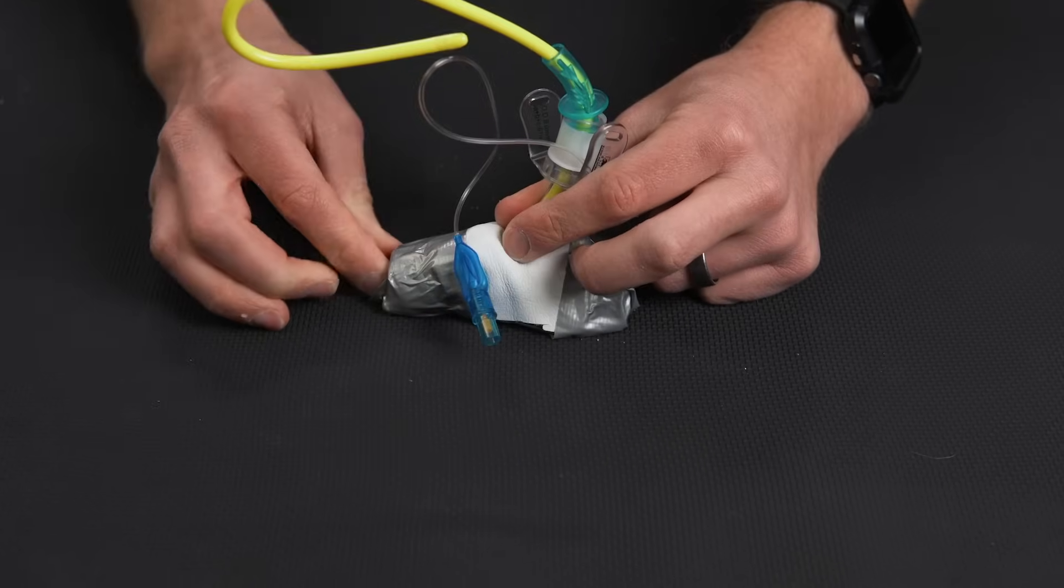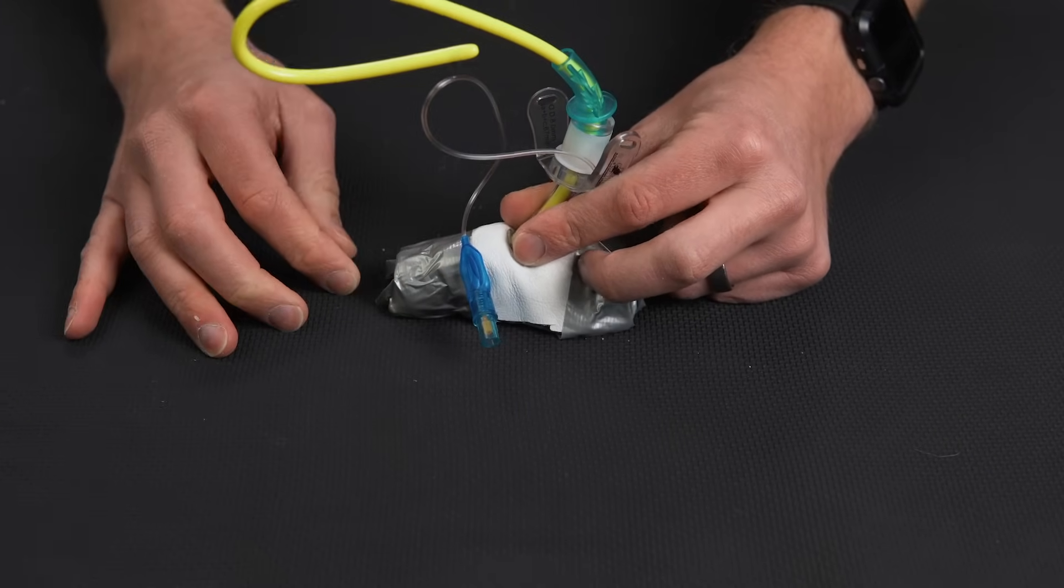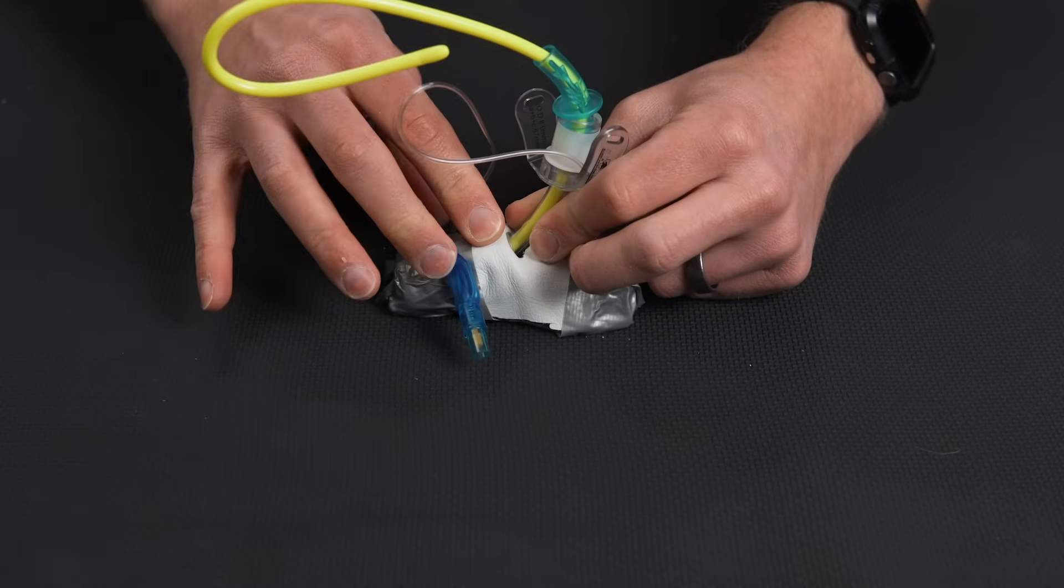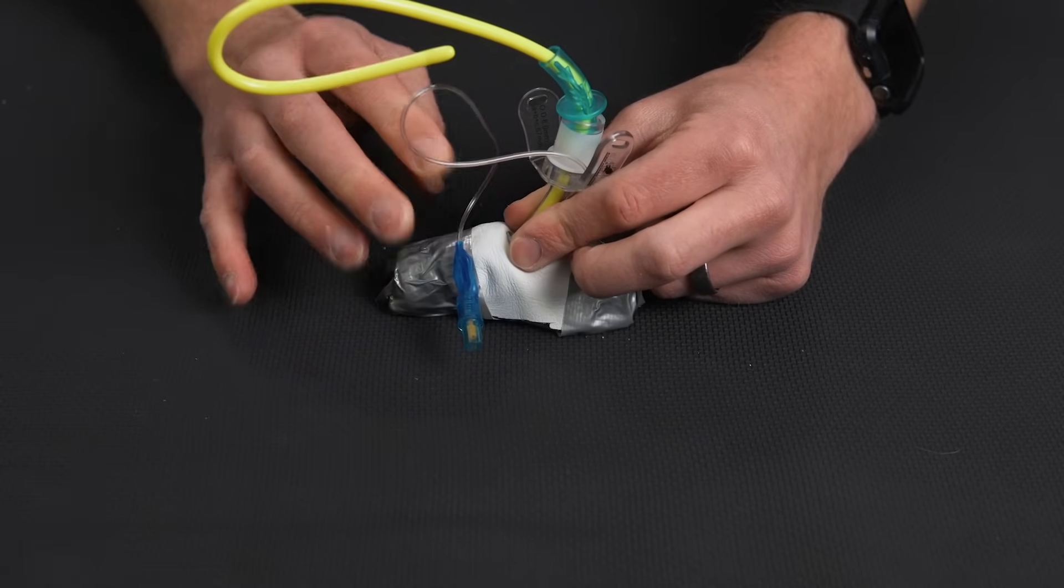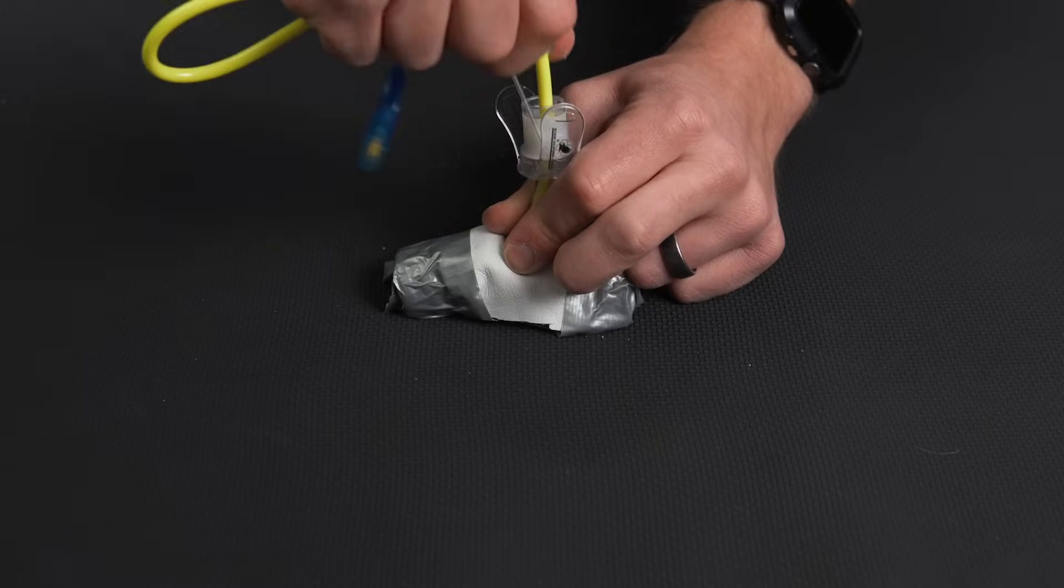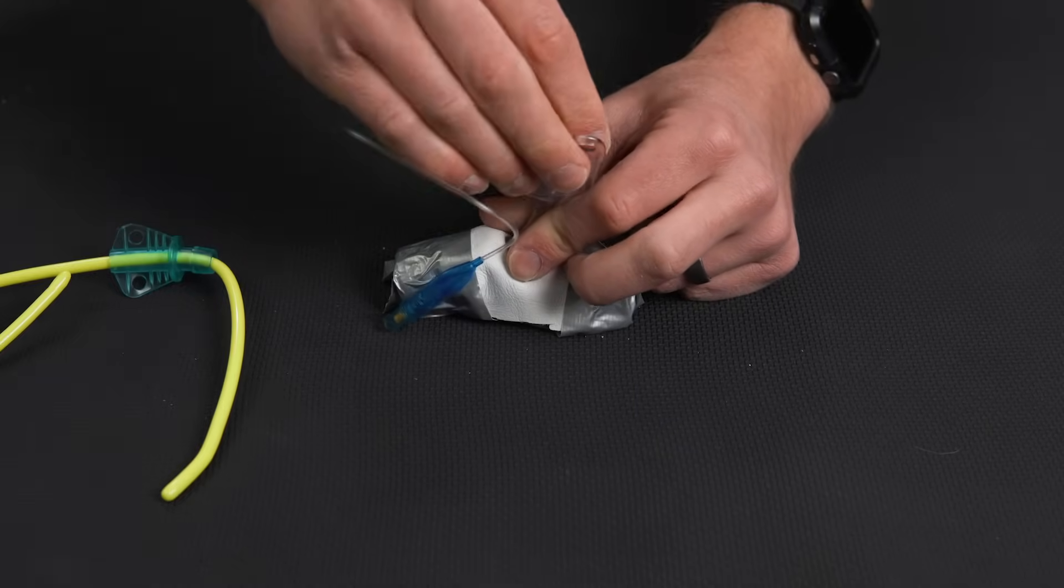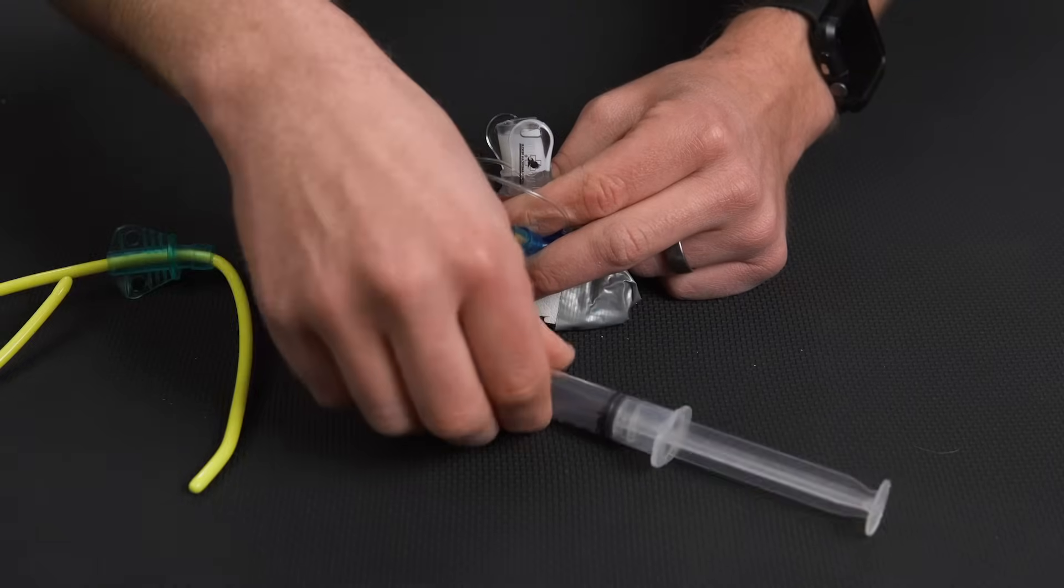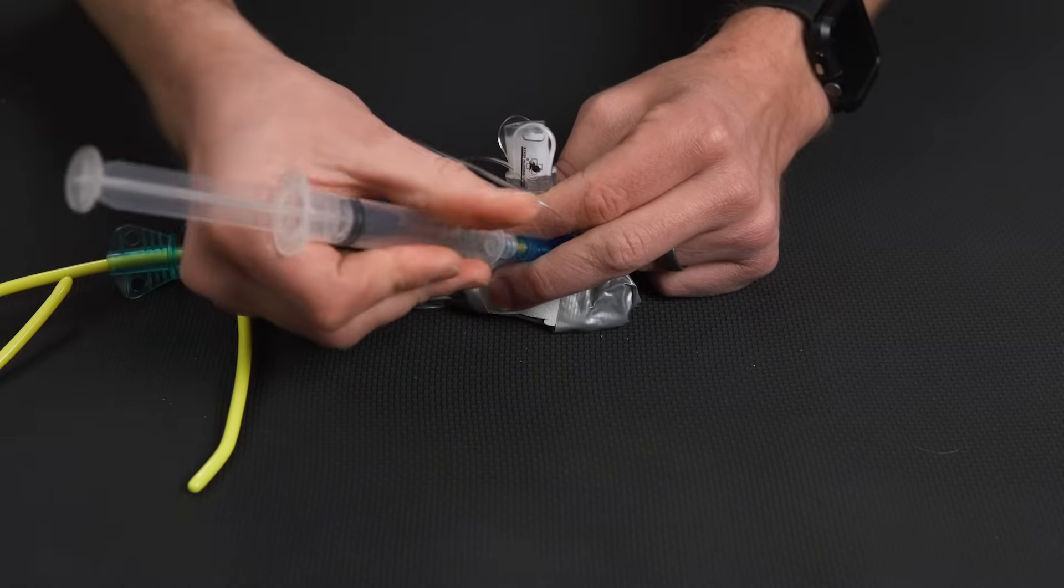So we have the tube in place and we want to make sure the balloon is all the way into the trachea, but only so. We can then take the bougie, take that out, make sure this is sitting right where it needs to be, and then inflate the balloon with the recommended amount of air.